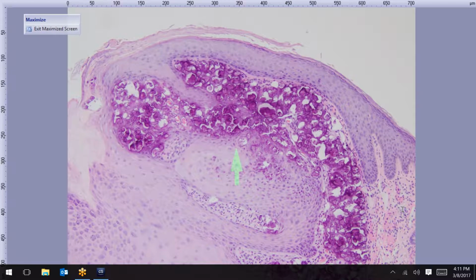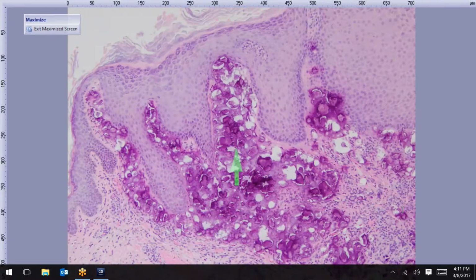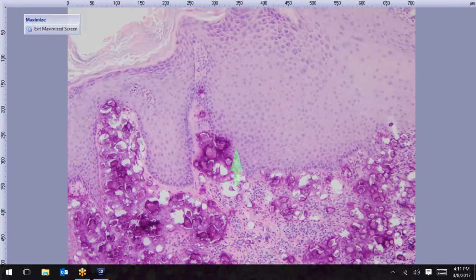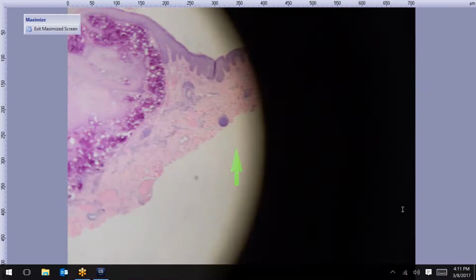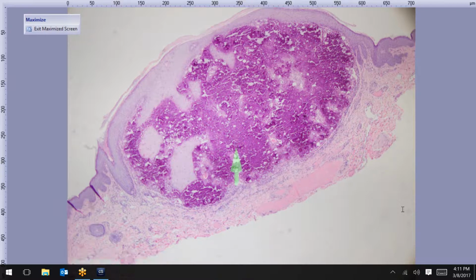So this is an entity that's known as a sub-epidermal calcified nodule. That's the clever name they came up with, but if you look it up, that's just what it's referred to. Sub-epidermal calcified nodule, usually in kids, head and neck region, idiopathic, just a subtype of calcinosis cutis with no implications.